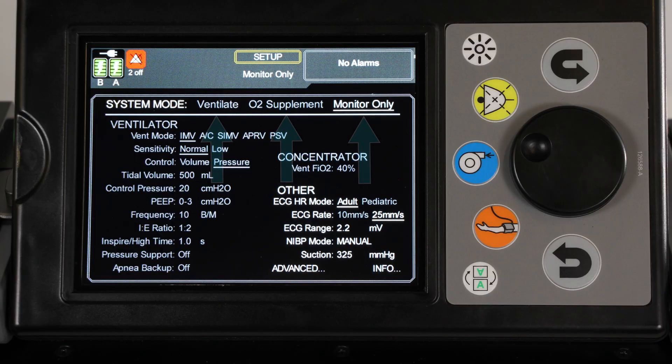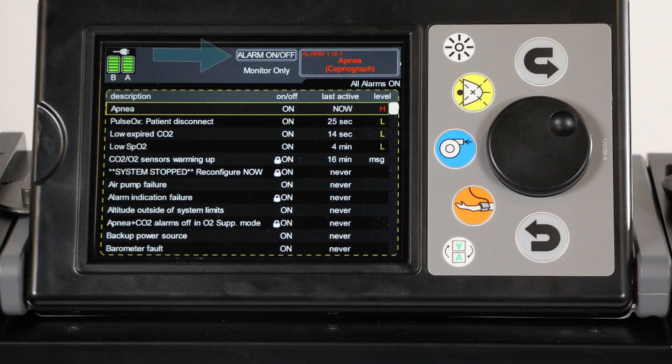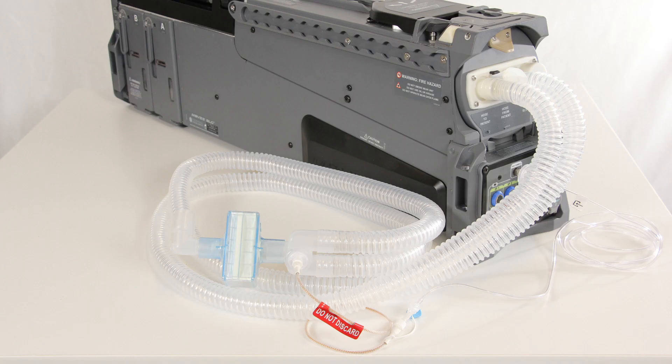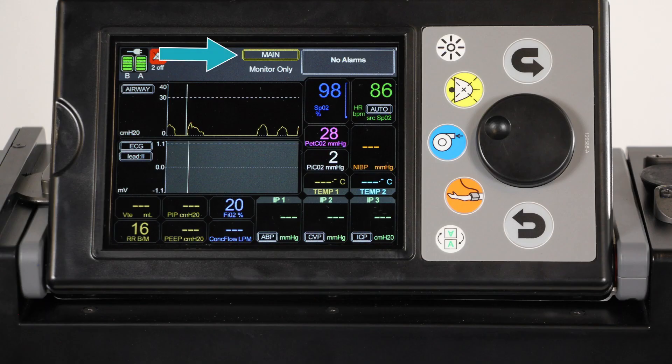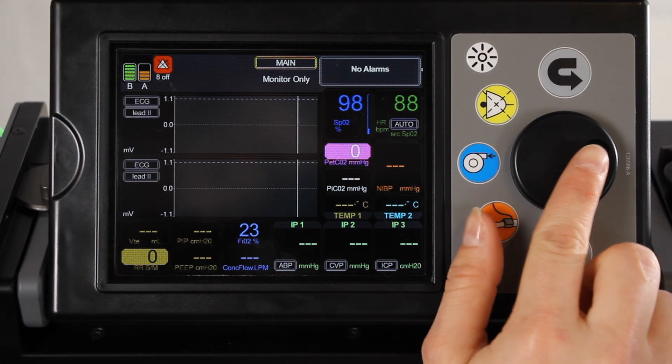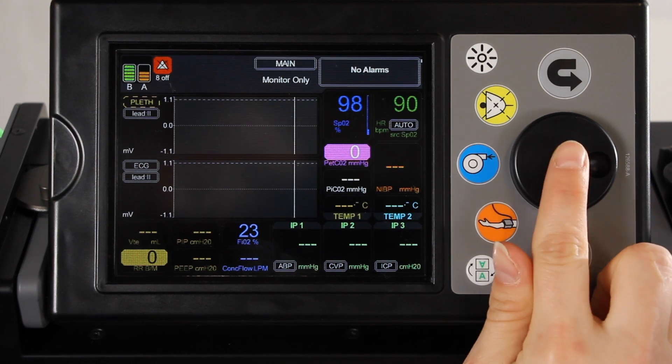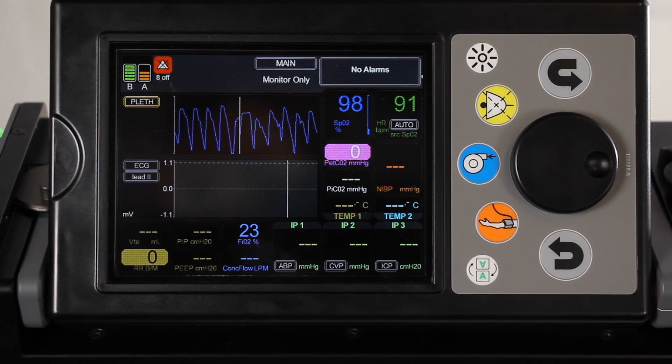Select the desired operating mode: ventilate, O2 supplement, or monitor only. To change any alarm settings, navigate to the alarm on/off screen or the alarm limits screen. Attach the breathing circuit to the patient. Navigate to main on the screen select button to view the monitor screen. To view patient charts and trends of patient data from within the monitor screen, select either of the waveform chart control buttons.